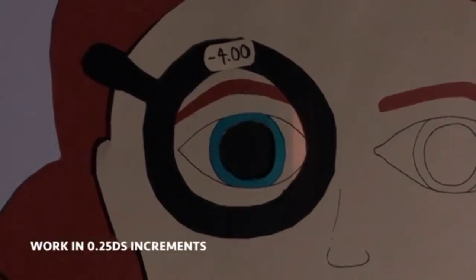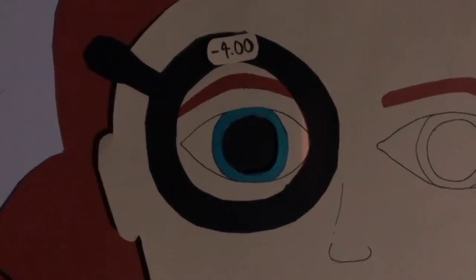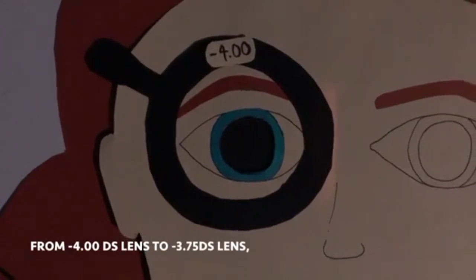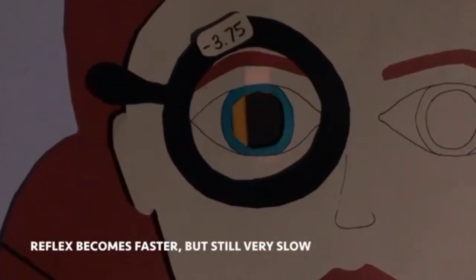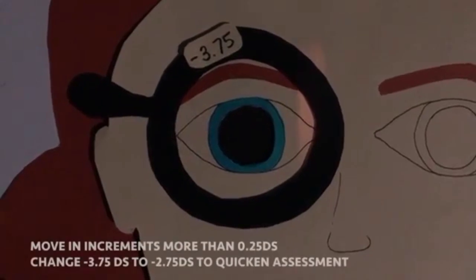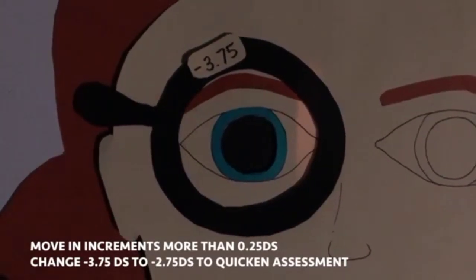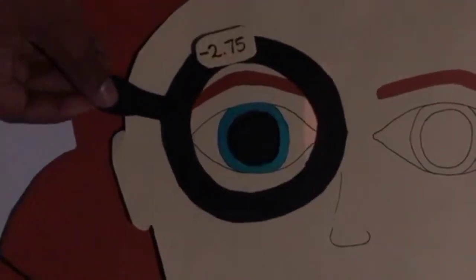Conventionally, we work in 0.25 increments, but this depends on the characteristics of the reflex. For example, moving from -4 to -3.75, the reflex becomes faster, but it is still very slow. Therefore, we need to move in increments more than 0.25. So now we add the lens power of -2.75 to quicken the assessment.